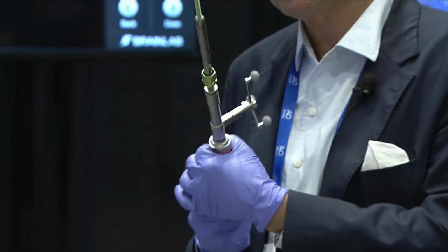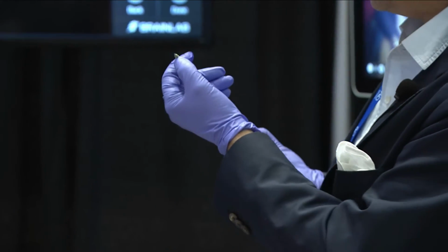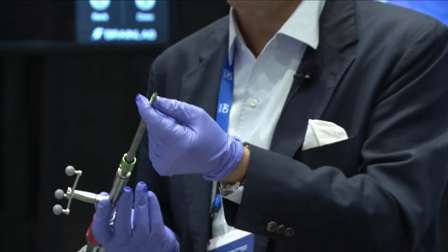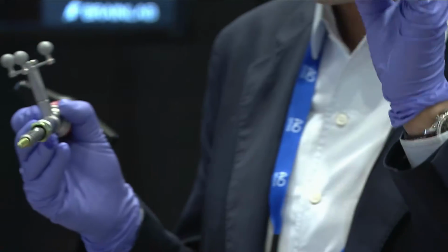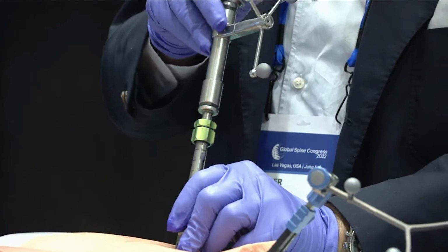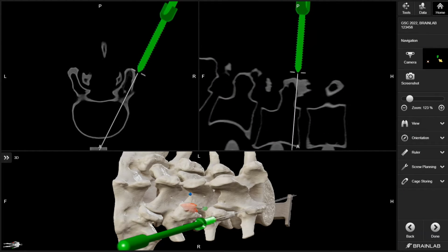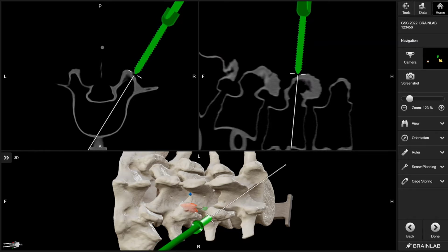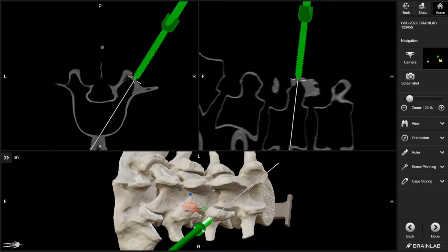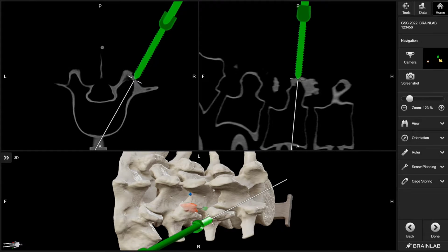You can, because when you put in the pedicles, you advance the K-wire. I don't know if you can see that where the camera is, but the K-wire is actually sticking out, so that acts like a docking point. So we'll go down through the fascia. I like to hold the screw right here at the skin edge. And then I find my trajectory for the pedicle screw, and then I hold it here. I confirm, gentle tap.